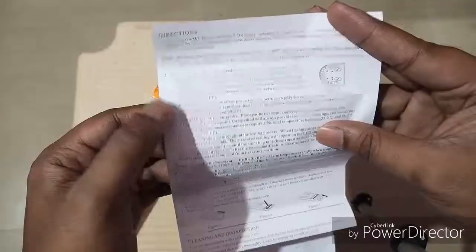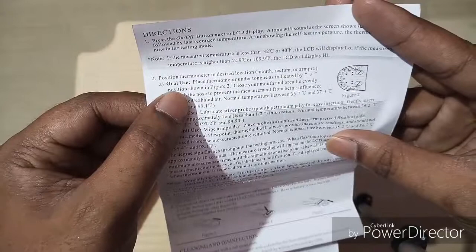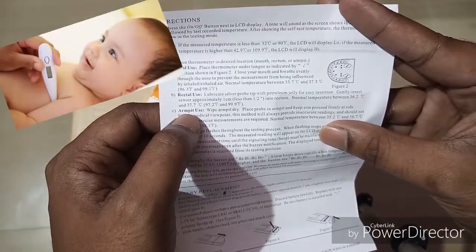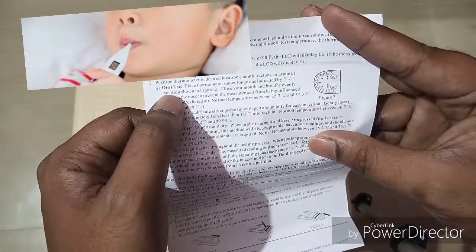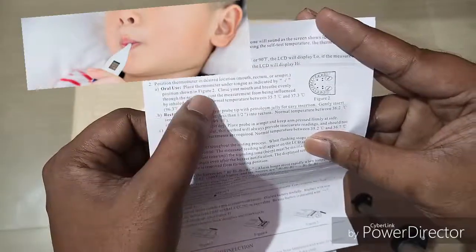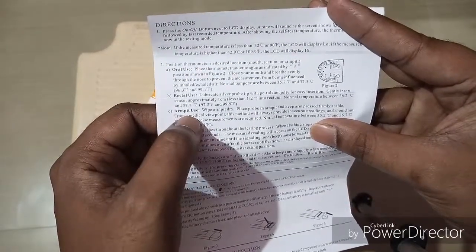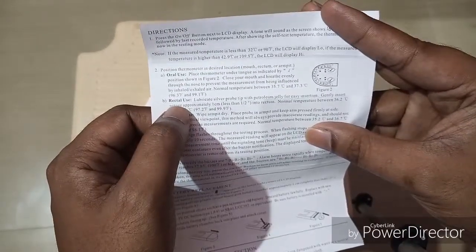The thermometer can be used in three ways: oral use, rectal use, and armpit use. Most people use it for armpit use. Oral use is less common — clinics and hospitals don't typically use it that way, but at home you can use oral. Oral gives a clearer temperature result. Armpit use is not perfectly accurate but almost exact. The most accurate is rectal use, but that is mostly not used nowadays.